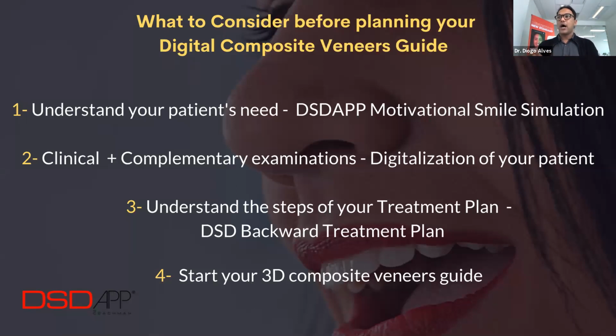And that's why I was saying before about having the patient become a co-designer of your smile. So as soon as your patient comes into your office, you listen to your patient, but you also let this patient know that you have this amazing application that will allow you to design a smile that fits the facial structure of that patient, which will create a harmonic smile. Look how amazing that is? You start your communication, your engagement, right on the first visit.